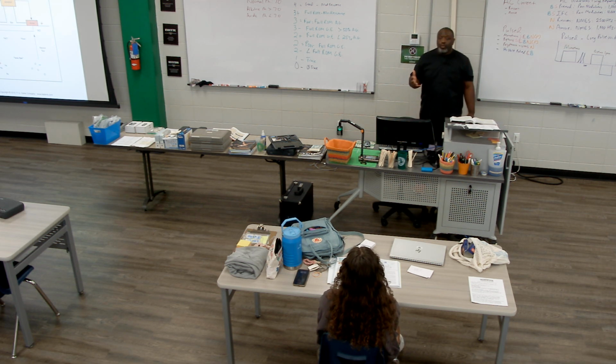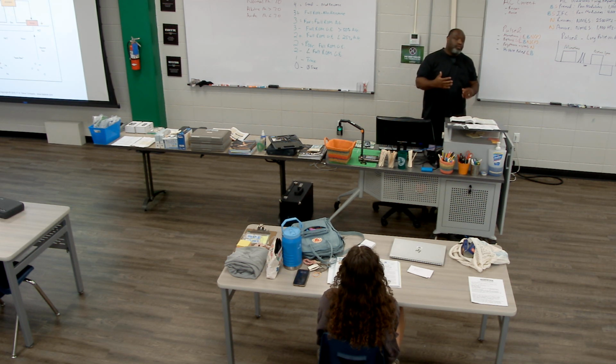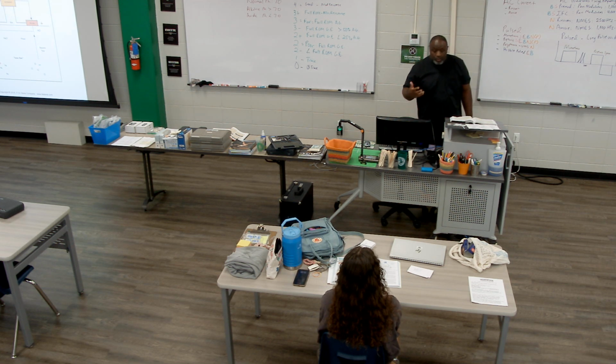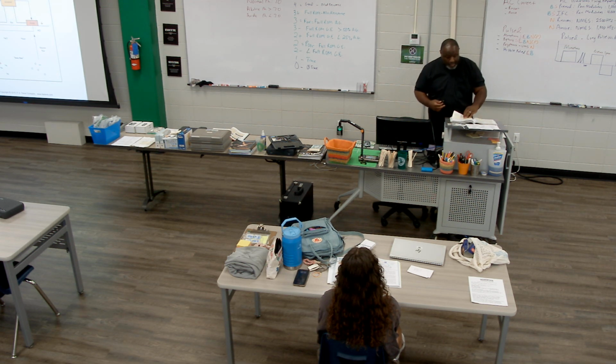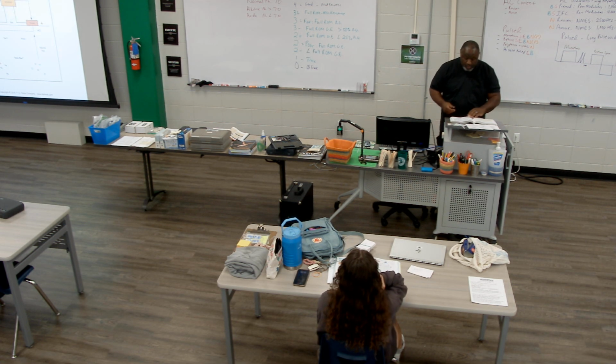What we use direct current for related to E-stim is wound care for one, and iontophoresis for the other. Iontophoresis is our really big thing that we used previously, but again, they don't reimburse for iontophoresis, so a lot of places have stopped doing it. I've reached out to some friends who are still practicing and asked them, are y'all still using iontophoresis, what devices are you using, and everybody's like, every blue moon we may pick it up.